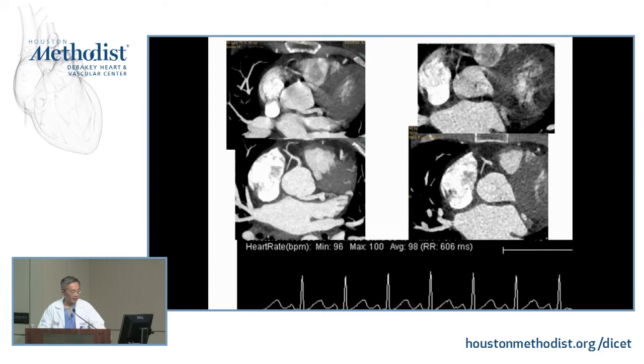This is another example. The patient's heart rate is not so irregular. You can see between 96 and 100, an average of 98.